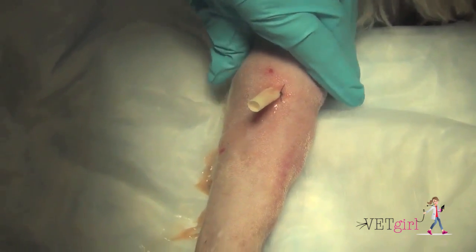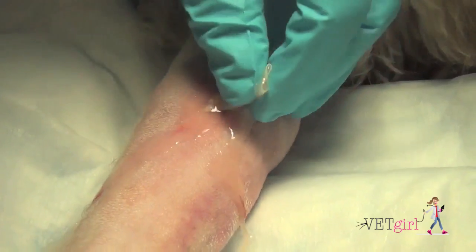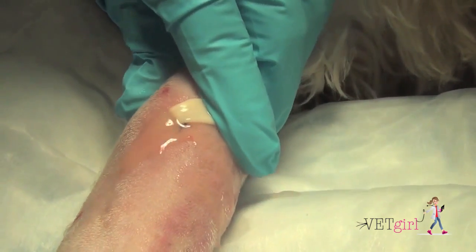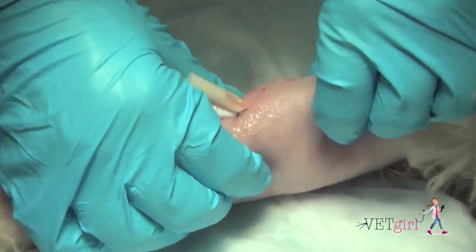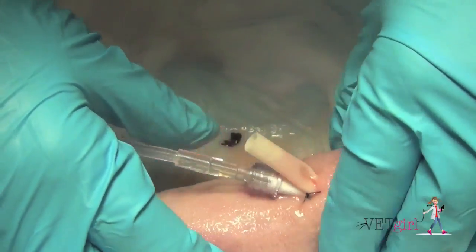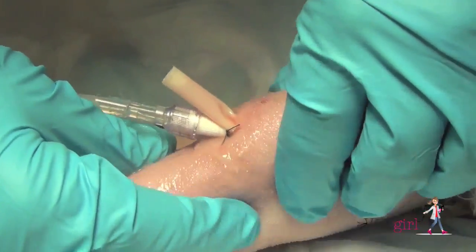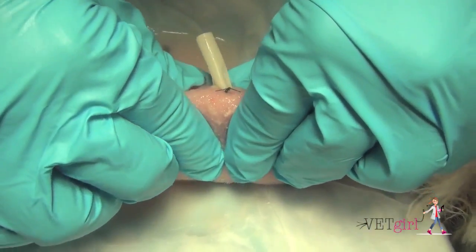Remember, dilution is a solution to pollution. So here we're going to flush copiously — you can see the purulent discharge coming out of the drain itself. We're going to do this until the fluid becomes clear, using several hundred milliliters of regular 0.9% saline to help lavage this area and flush it well.